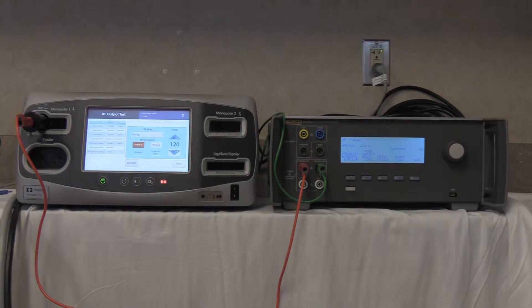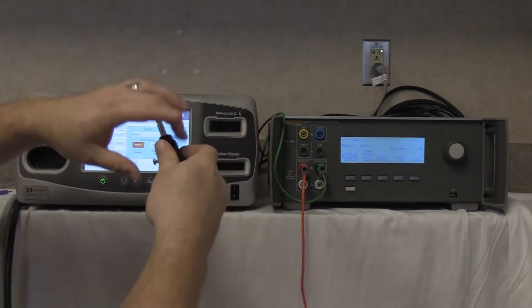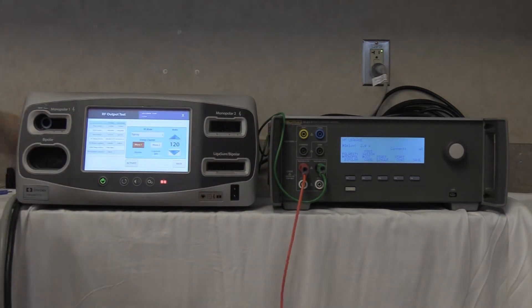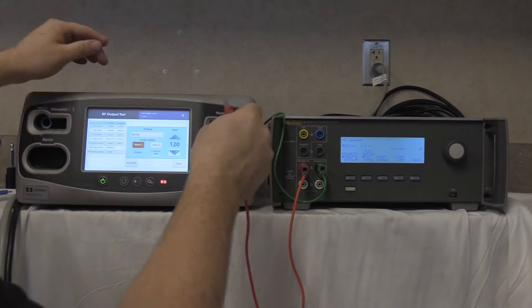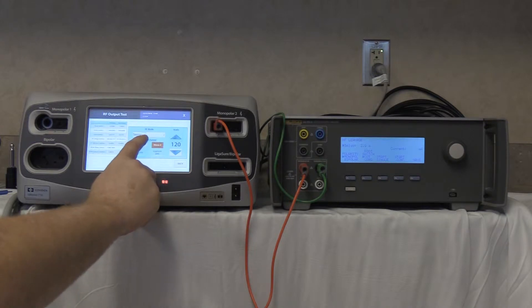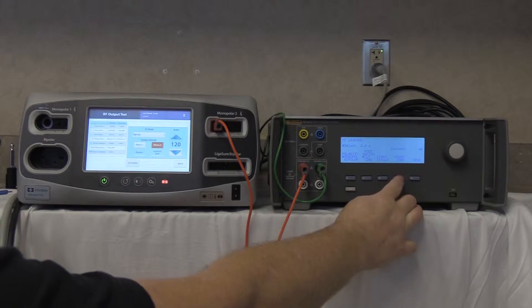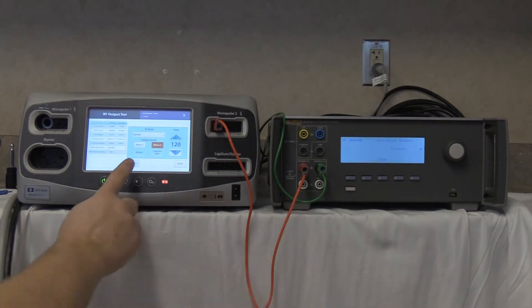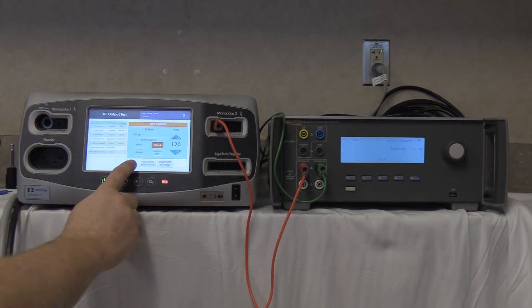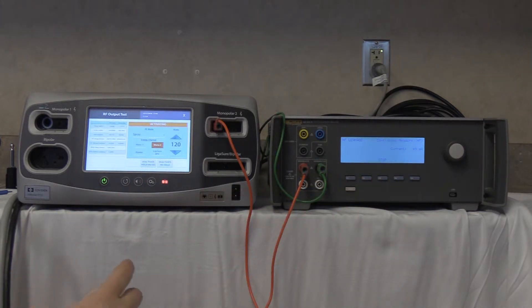Next, test monopolar 2. Disconnect the plug from monopolar 1, disconnect the adapter, and plug into the monopolar 2 leftmost port. Select monopolar 2, spray at 120 watts. Start continuous on the QAES-3 and activate on the FT10. Our reading is 49 milliamps — below the 150 milliamp threshold, so this passes. Deactivate and stop on the QAES-3.